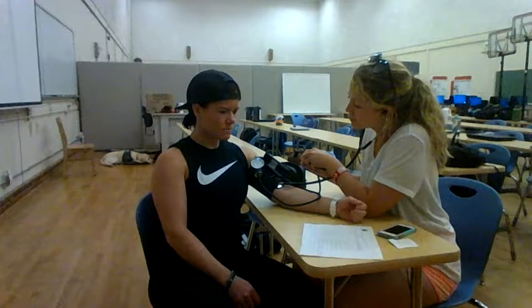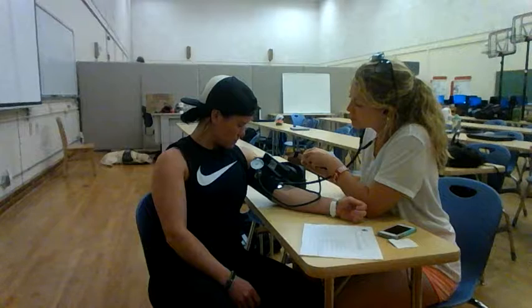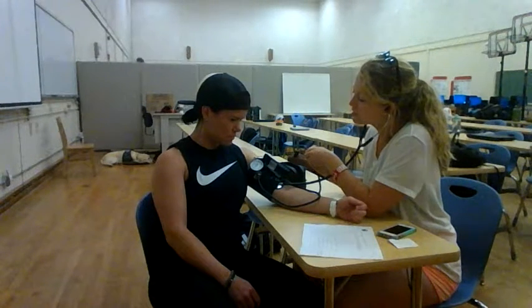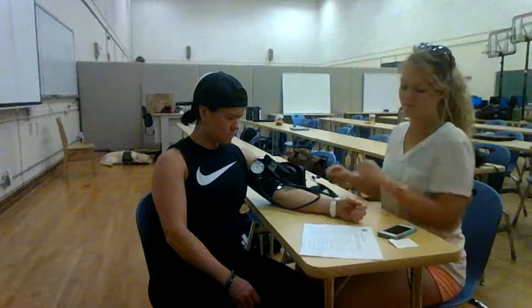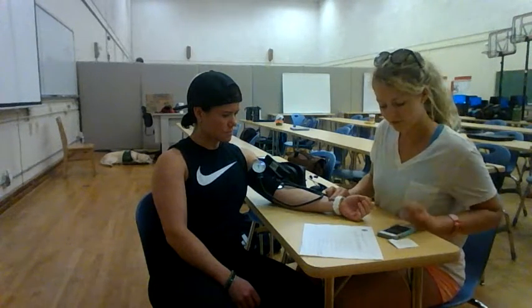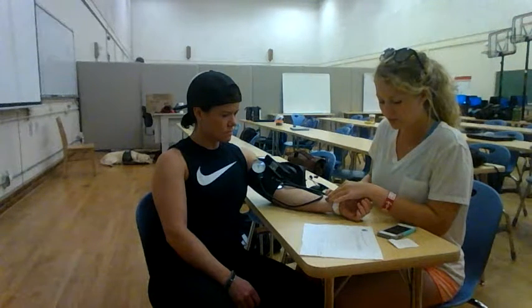Once steady state is reached, we will take blood pressure and ask the subject's RPE, which is relative perceived exertion, and then increase the workload. Once the workload increases, we will have the subject go until they reach steady state again. Once they reach steady state, we will repeat the process of taking blood pressure and measuring RPE once more. We will continue this process until the subject reaches 70% of their heart rate max.